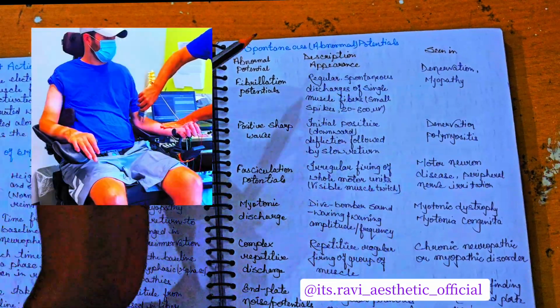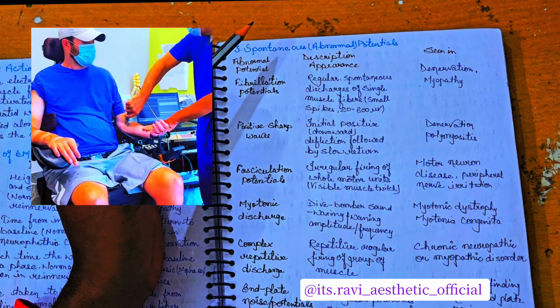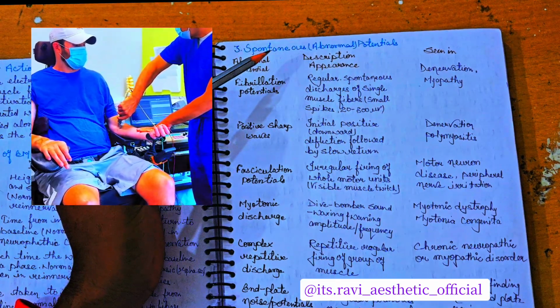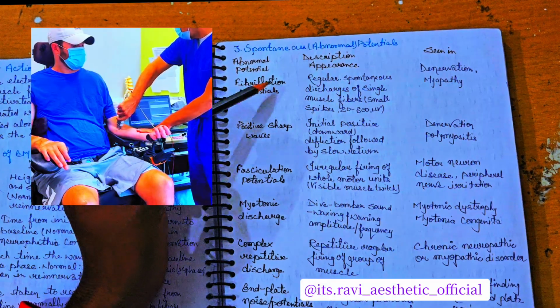Our next part is spontaneous abnormal potentials. In electromyography, abnormal potentials are found, such as the fibrillation potential. So what is that?